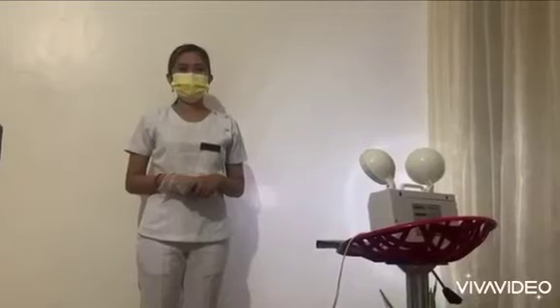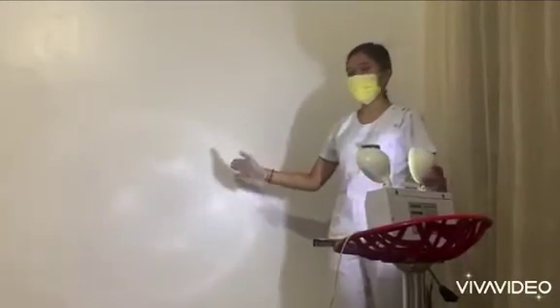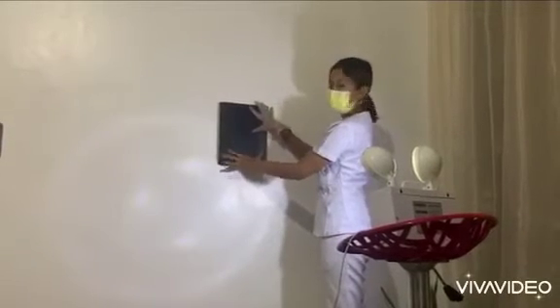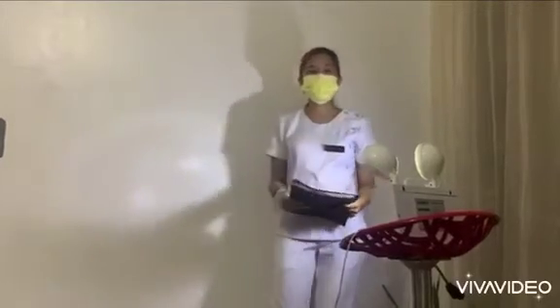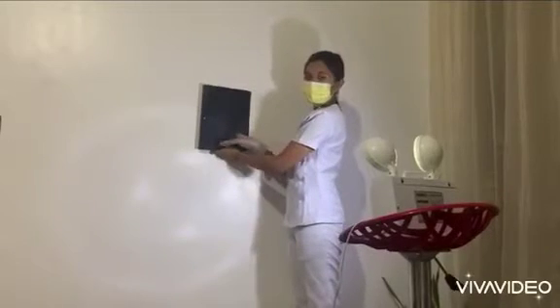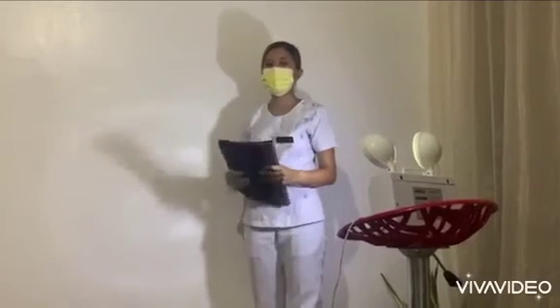For this, we're keeping our collimation open to 10 by 12, but this 10 by 12 is going to be lengthwise. So the 10 by 12 lengthwise means the 12 inches is your length. It's longer versus width. Now, we need to take our IR and turn it lengthwise, like this. The reason we are doing this 10 by 12 lengthwise is because we're going to include the scapula.